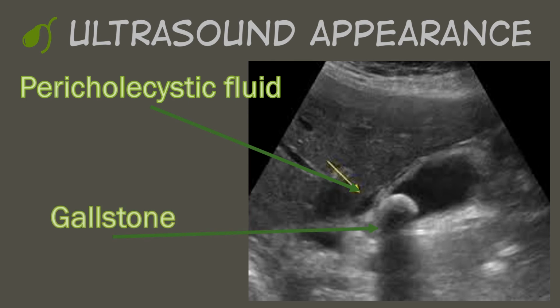Gallstones are also a very common aspect of acute cholecystitis. It's actually the reason why the acute cholecystitis exists. So you're going to typically find a gallstone up in the neck that is non-mobile as you roll that patient around.